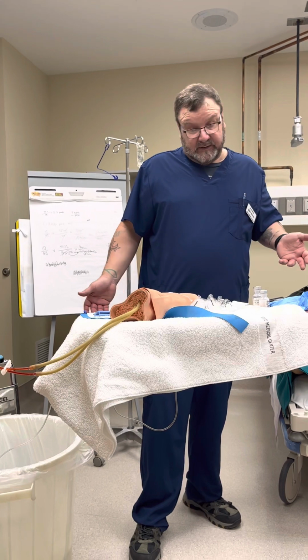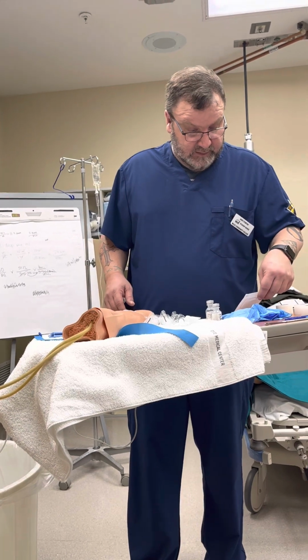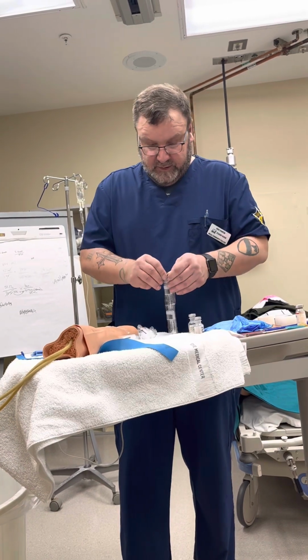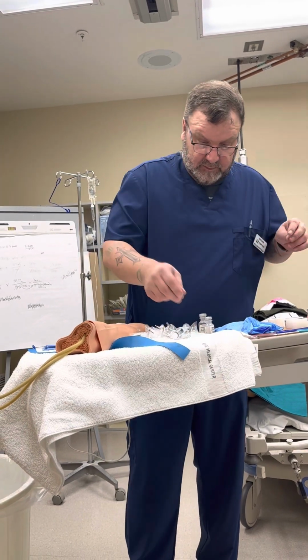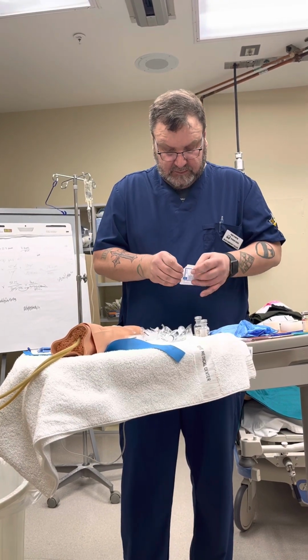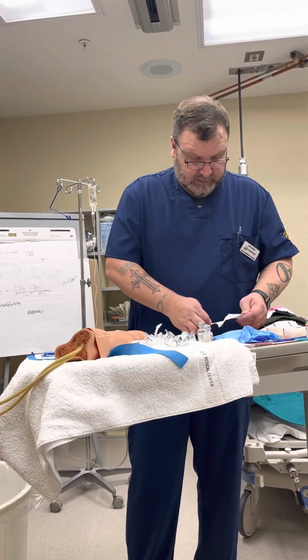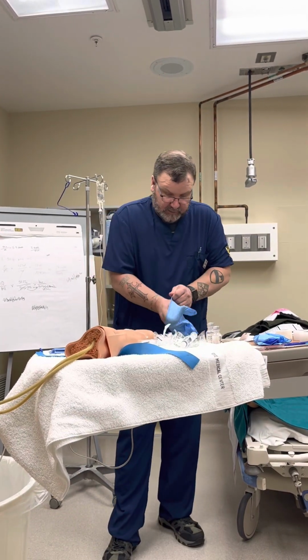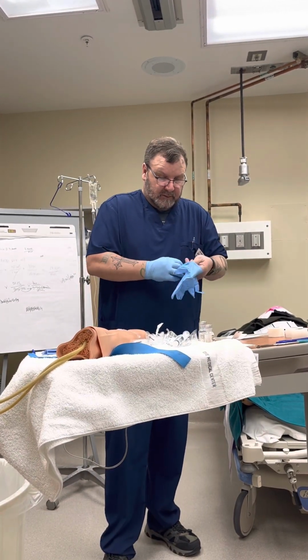At this point, I'm going to come in and I'm going to need to flush this. I'm all clean, I'm all ready to go here, but I'll get my flush ready in order to lock it. And I'm going to need some gauze. Gauze ready and an alcohol pad. I've done some hand hygiene. They're good to go. Put on the gloves.